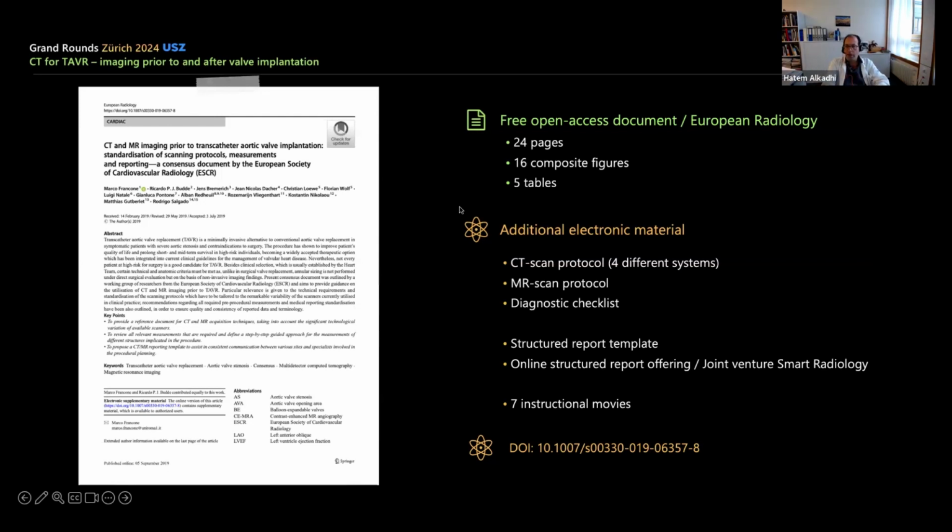from Mahmoud Abdel Shafi, referring to their own paper published this year in the Journal of Clinical Medicine. I just opened it with the title Predictors of Conduction Disturbances Requiring New Permanent Pacemaker Implantation Following the TAVI procedure, with the Evolute series, where several measurements and assessments were made, which were able to predict conduction disturbances after the procedure, including the membranous septum length, implantation depth, which is very interesting, which fits to the discussion that we had before. Yes, we don't do that systematically.